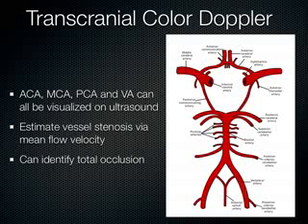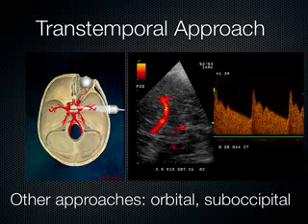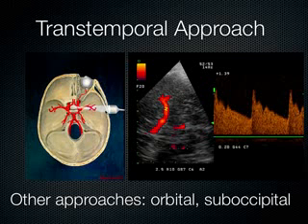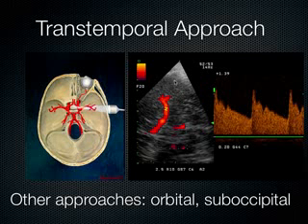It probably has a lot to do with the future of neurology and neurosonology, but we're just going to talk very briefly about what it looks like on ultrasound. So the transtemporal approach, where the skull gets very thin, the temporal bone: a low-frequency transducer, like a 1 megahertz probe, can penetrate right through that window and into the vasculature. And this is what brain looks like on ultrasound. This is all brain parenchyma here. Basically, it looks like thyroid or liver or something. I think probably more like liver than thyroid to me, but that's the idea.